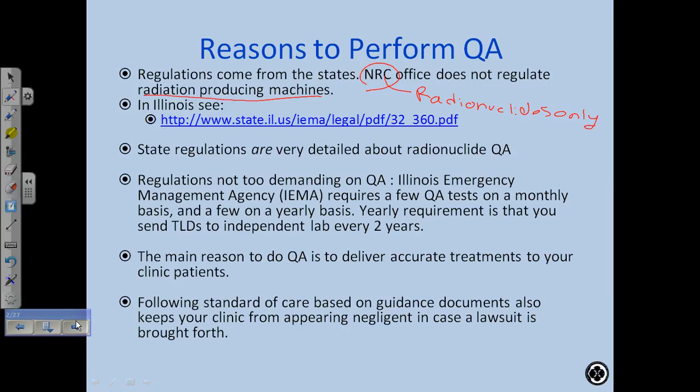So most of the QA talk today will pertain to radiation-producing machines and radiation equipment. I'm not going to go into brachytherapy or radionuclides too much. Does that make sense?